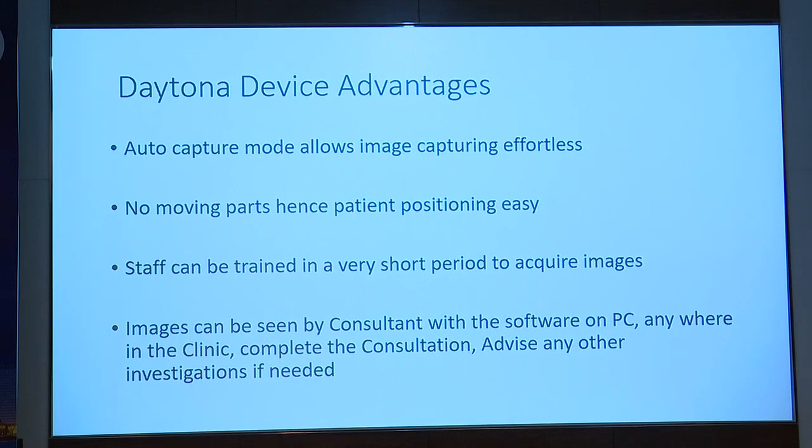You saw how my color photograph came with the machine because the technician was not good. And another advantage is that it's higher technology, so you can shift it anywhere you want.